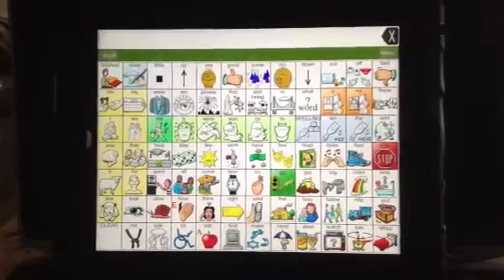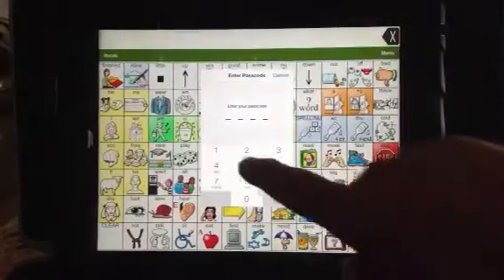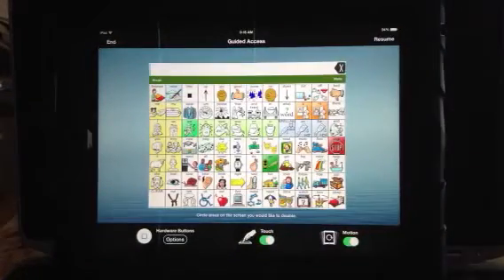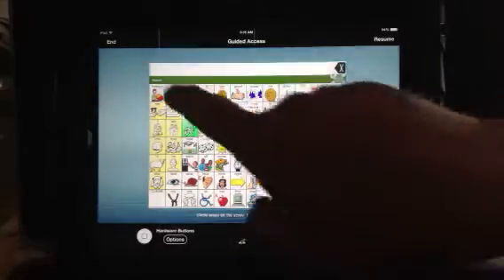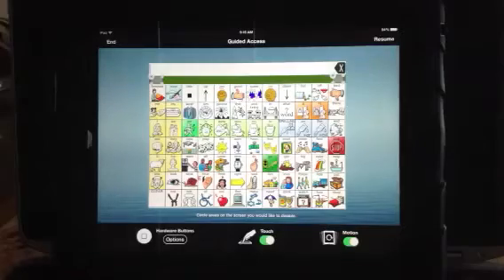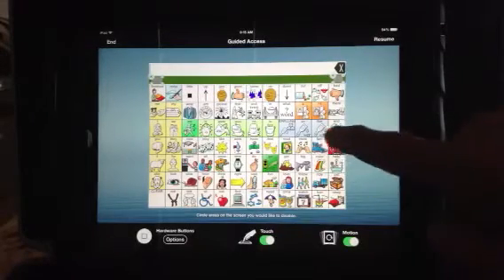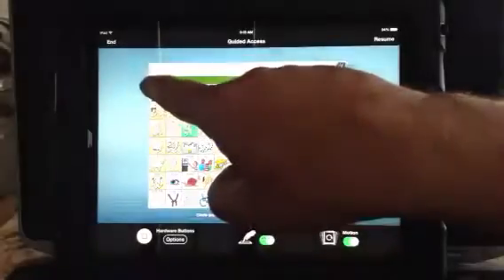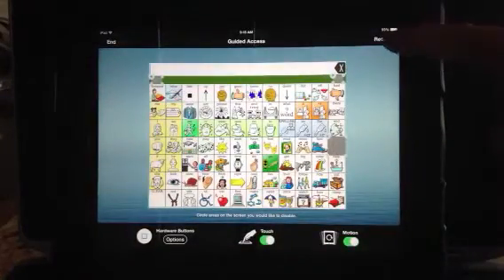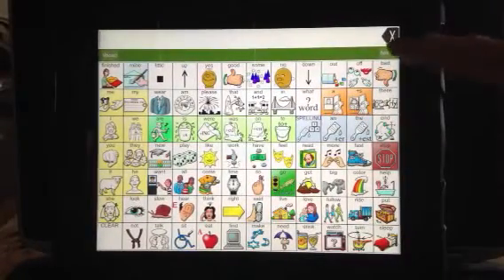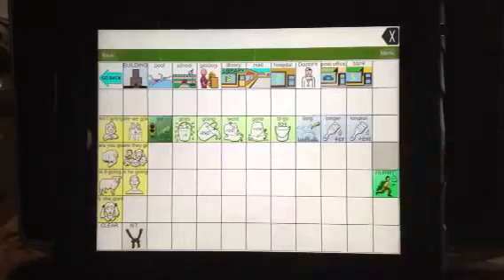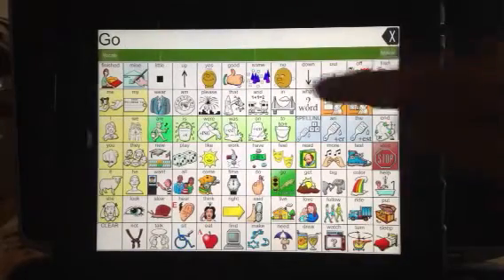Now I'm going to hit it again. This is where you have to know the passcode to get out. This screen lets you circle what you don't want the child getting into. So I don't want him getting into these two menu items here. You can actually do an area on the grid — for example, you could say you don't want them getting into the stop sign. So I'm making this button not work, this button not work, and the stop sign not work. Then I hit Resume. You can just barely see they're a little gray, but those buttons don't work anymore. Everything else works fine, so the child can talk and use the device, but because I've turned on Guided Access, he can't get out of the app.